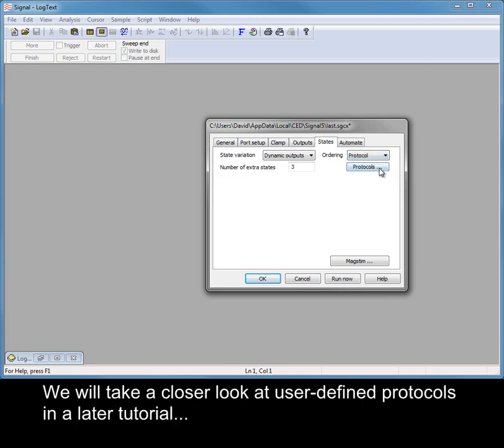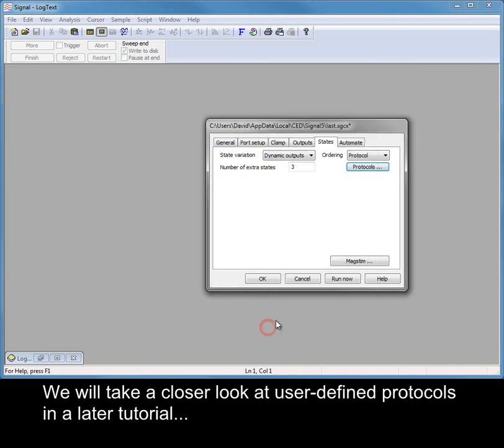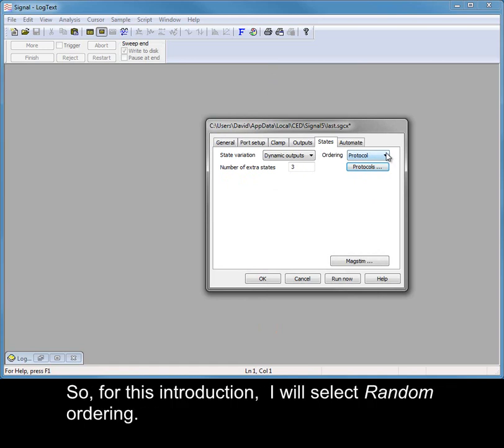We will take a closer look at user-defined protocols in a later tutorial. For this introduction, I will select random ordering.